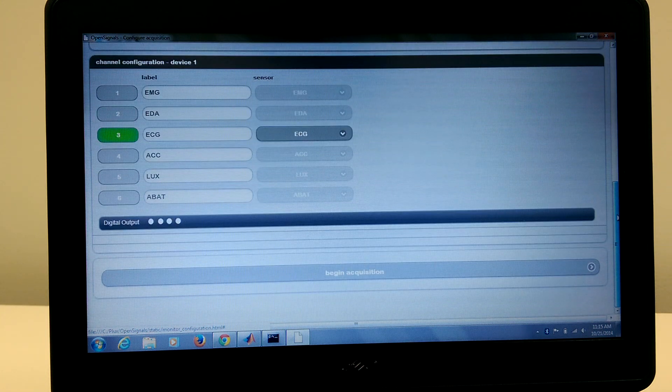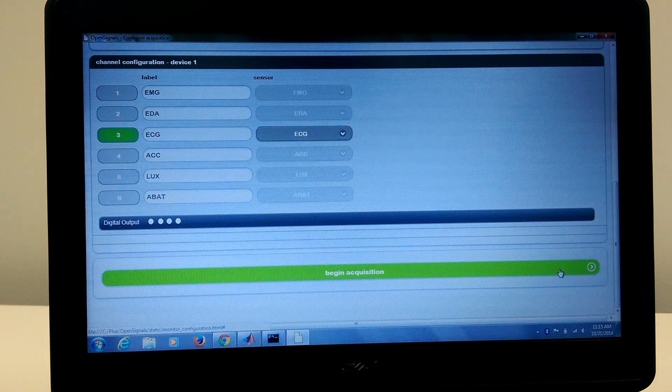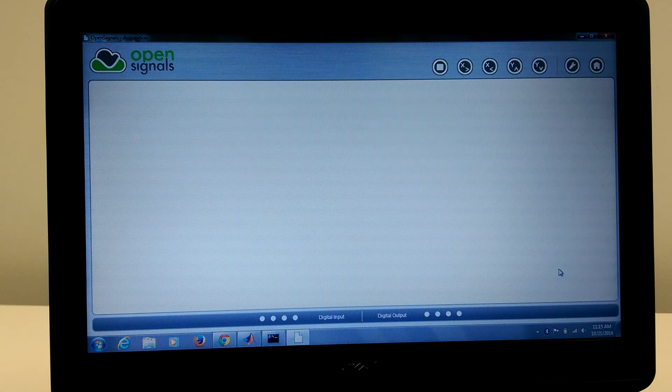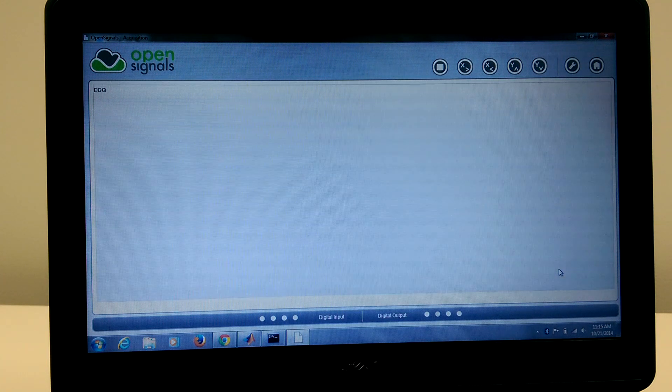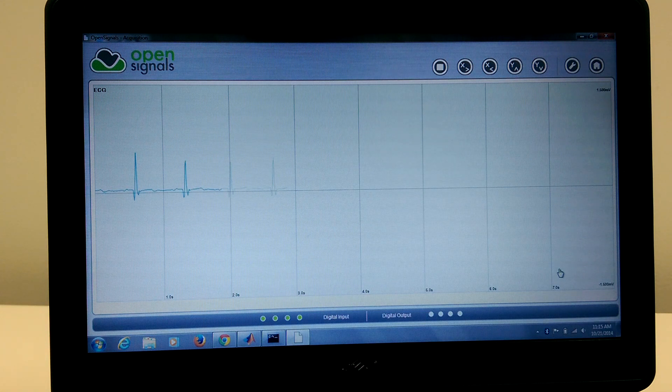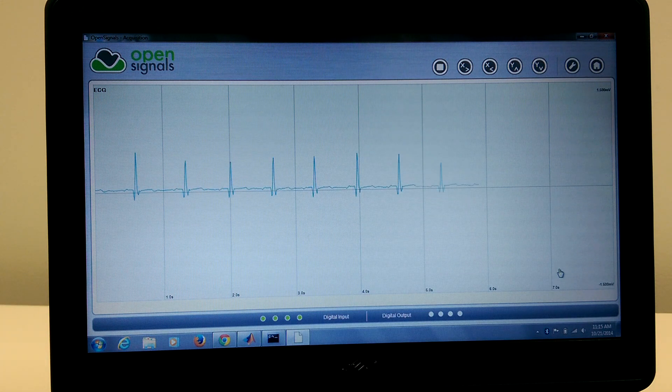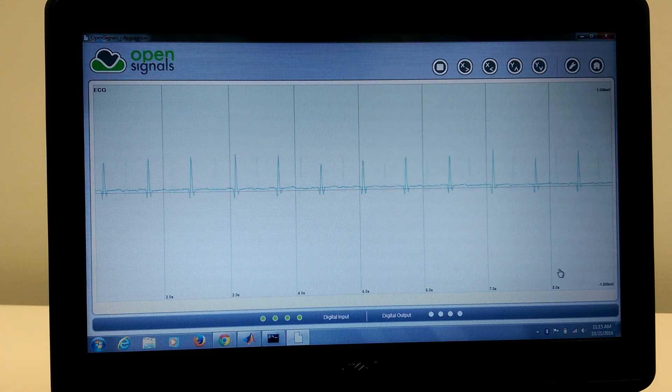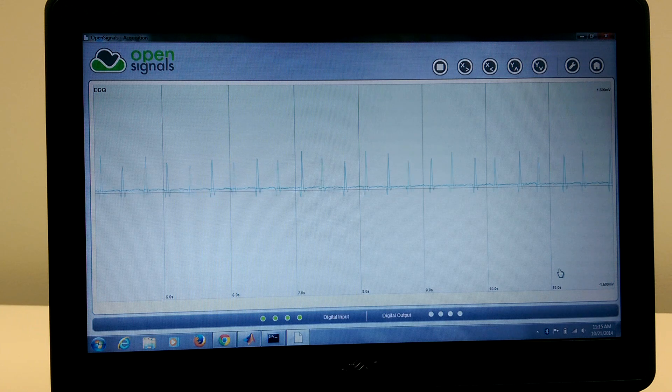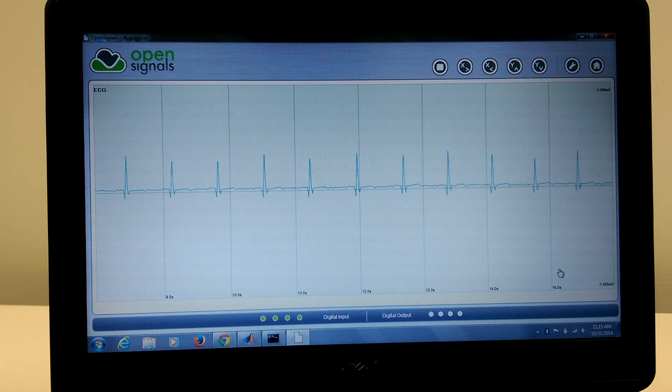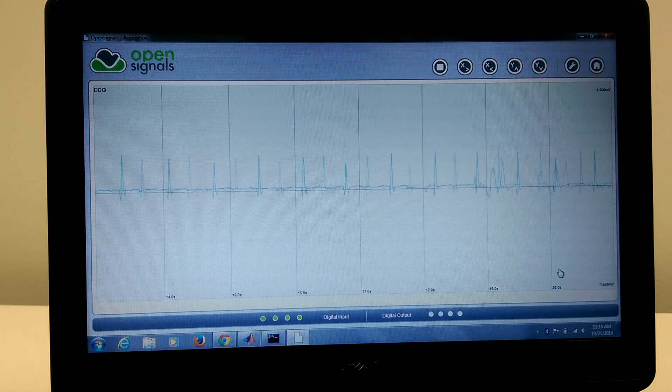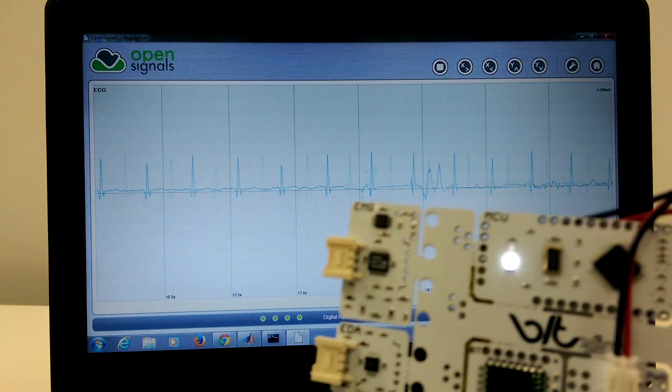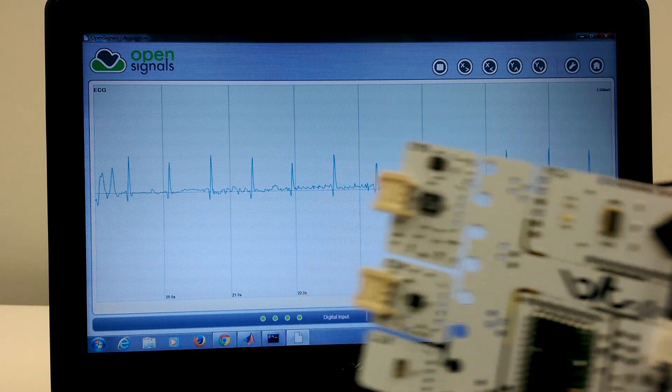So moving on, we now can go to begin acquisition. We return to the main screen, the initial screen that we went to, and we just give it a few seconds to start processing. And now it's actually collecting live data. As you can see, this is my heart rate in real time being updated live and being collected at 100 Hz, so there's actually 100 samples per second. And if you look at the actual board, you can see that it is blinking much more rapidly than before when it was in standby mode.